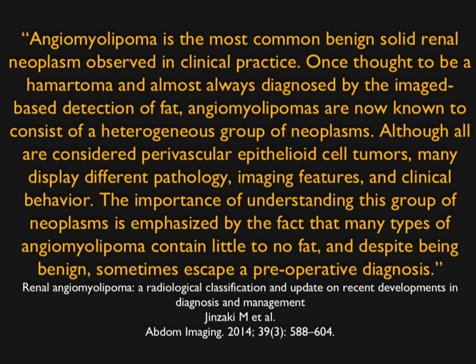This article by Jinzaki says AML is the most common benign solid renal neoplasm in practice, once thought to be a hamartoma and almost always composed of fat. They're now considered a heterogeneous group of different tumors, but all of these are going to be benign, although sometimes, as this article mentions, they escape a preoperative diagnosis because there just is no fat within the lesion.